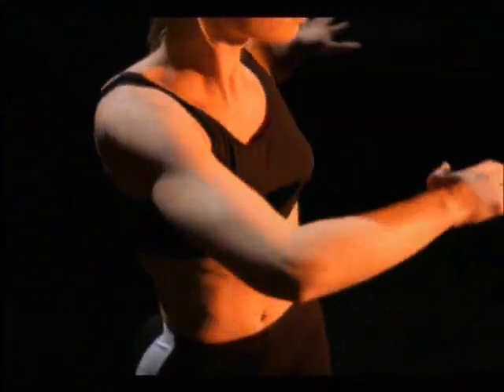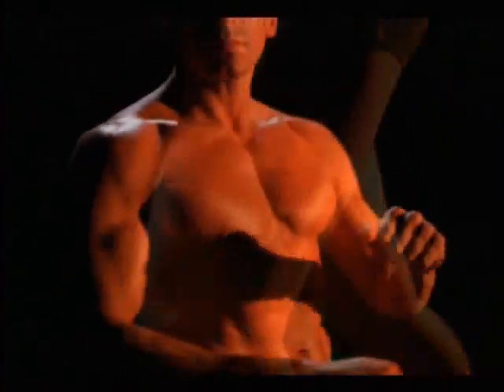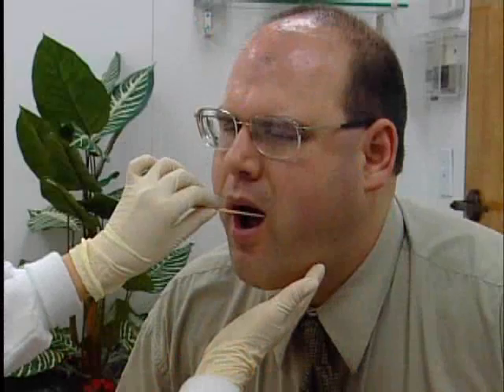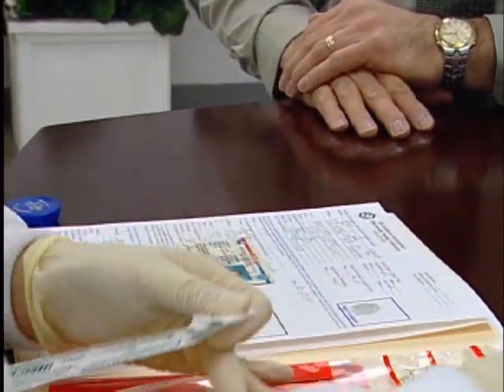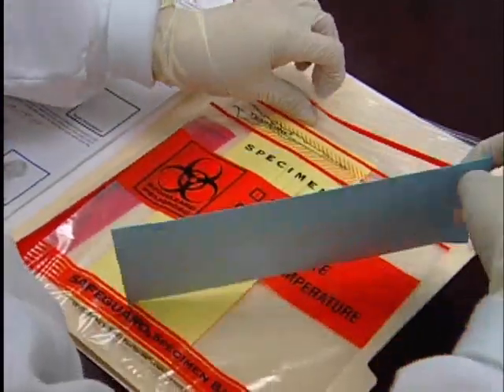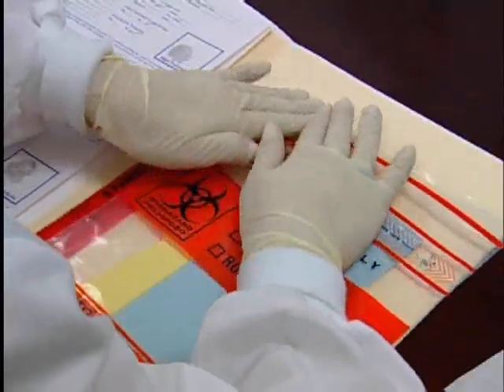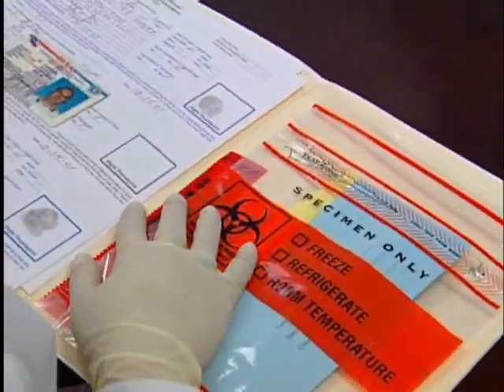DNA is the same in every nuclear cell of a person's body, so whether examining epithelial cells or white blood cells, the DNA is the same. The possibility for contamination may be higher with buccal swab samples, but if collected and sealed appropriately, contamination is unlikely. When placed into packaging as instructed, buccal swabs are allowed to air dry, which means they can remain viable for quite a long time — even months — though it is recommended that all samples be returned to the laboratory within a week of collection.